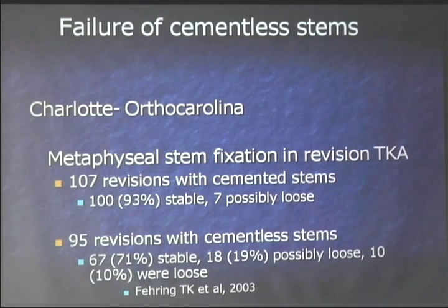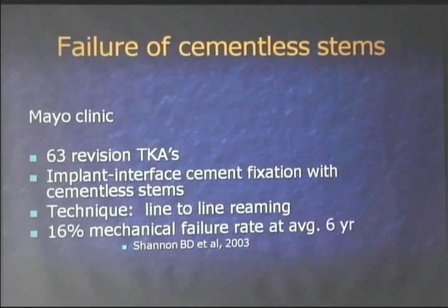So Tom does favor cemented stems, but he also says that this was really with the metaphyseal cementless stems. If you were to ask him, he doesn't mind cementless stems, but he emphasizes that if you're going to use a cementless stem, you've got to get into the diaphysis and get good diaphyseal fixation. I think that's the real take-home message from this paper.